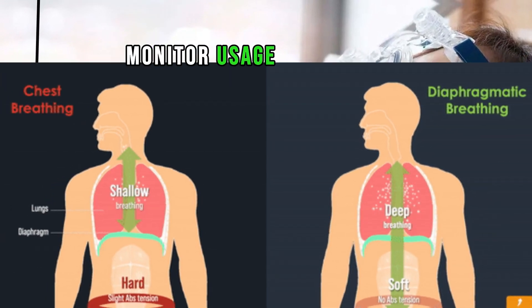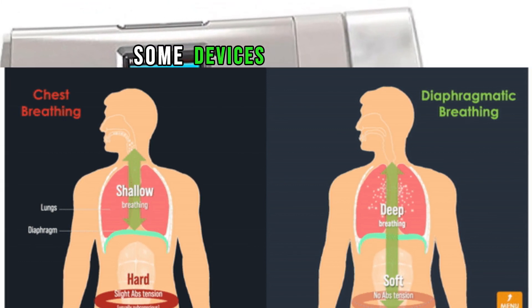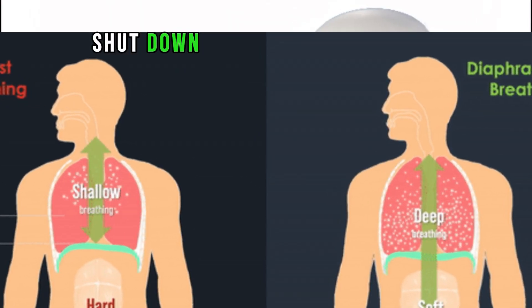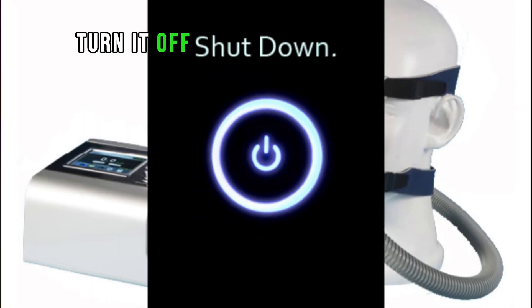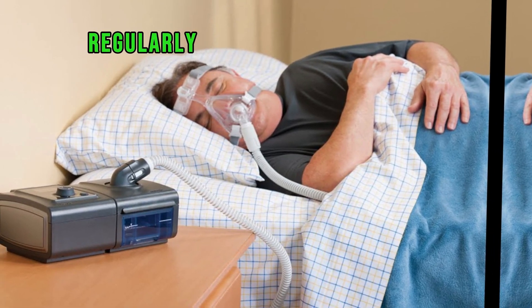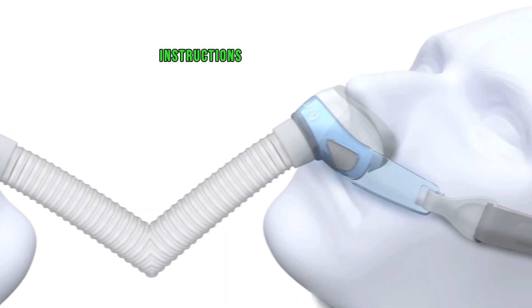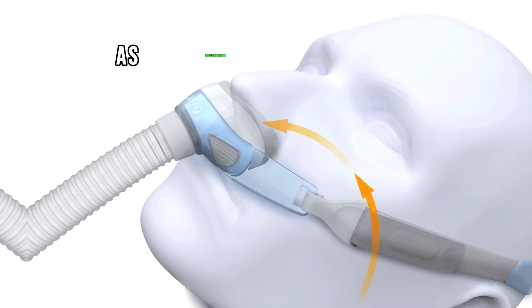Monitor usage — pay attention to any indicators or displays on the machine. Some devices provide information about mask leaks, therapy duration, and other data. When you wake up or finish using the BiPAP machine, turn it off by pressing the power button. Regularly clean and sanitize the mask, tubing, and humidifier components as per the manufacturer's instructions. Replace any disposable components, like filters, as recommended.